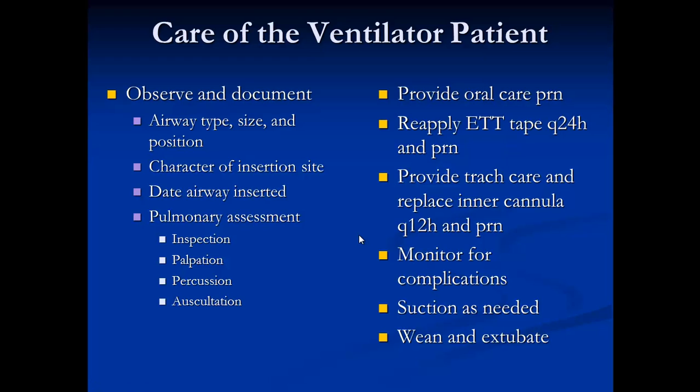As a nurse and nurse practitioner, you have to always observe the type, the size, and the position of the tube at the bedside. If you remember that it was placed at 22, it must continue at 22 unless it's dislodged. You could also see it in the chest x-ray, and I'll help you in class how to actually look at the proper insertion of the ET tube.